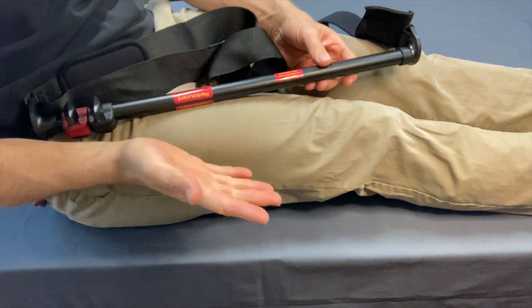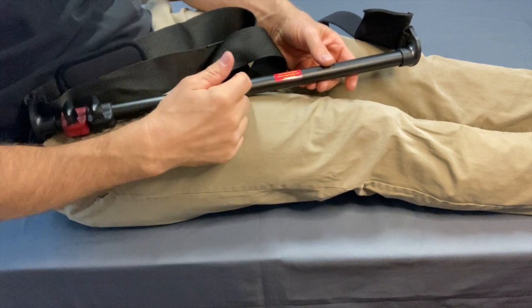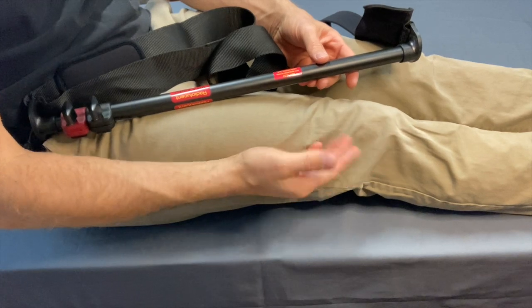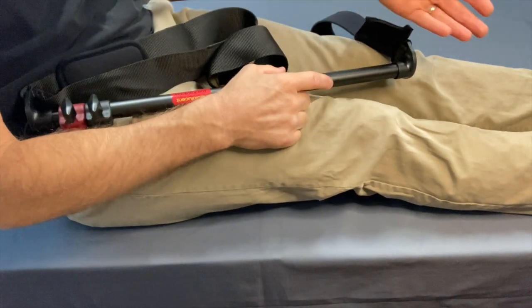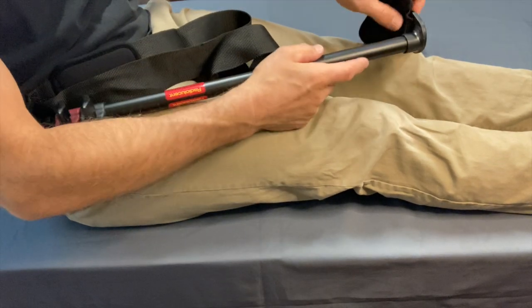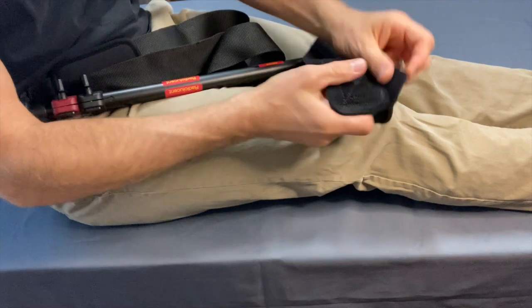Sam Slishman here. It recently came to my attention that people don't know you can use the STS femoral traction splint even if you have lower extremity trauma. Say you have a patient who has a sprained ankle, a tib-fib fracture, or maybe their foot was amputated — you can still apply this for femoral traction.